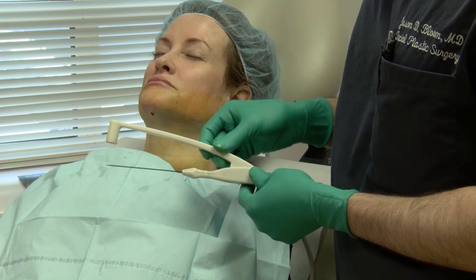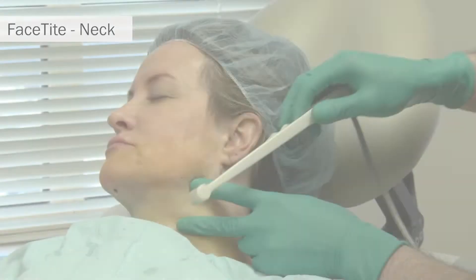This is a look at the FaceTite handpiece, consisting of a subdermal 10-centimeter probe and surface bipolar electrode.